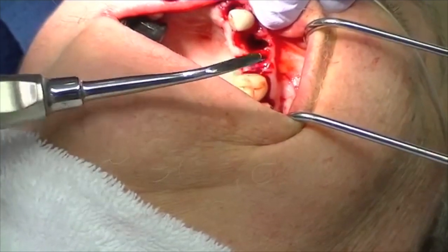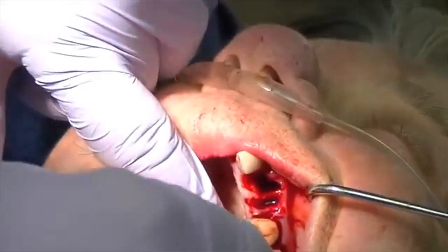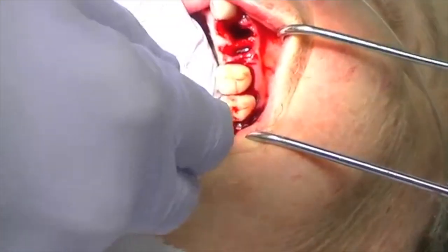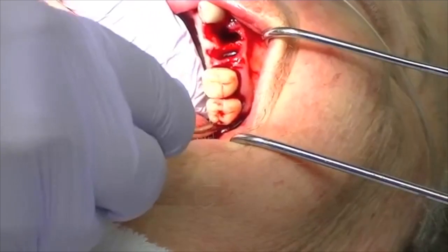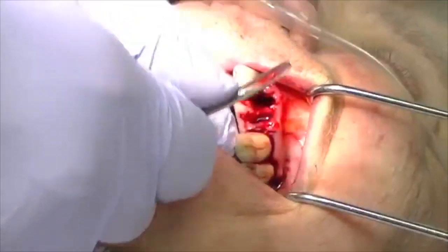Dr. Golden created a distal elevator that has a unique shape to it. What we want to do is detach the tooth from the tuberosity, so I'm going to use quite a bit of force here to break down the tuberosity attachment to that tooth.